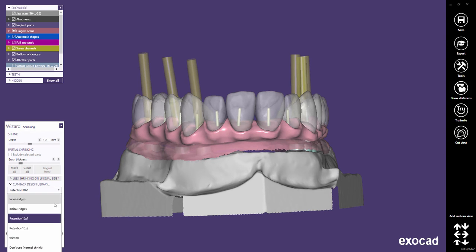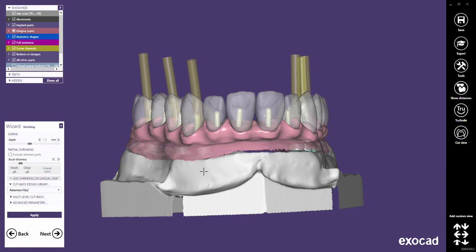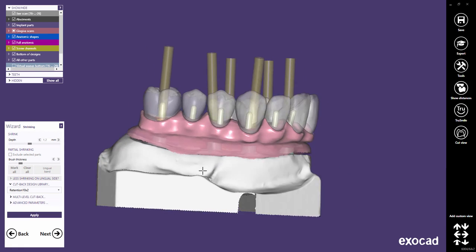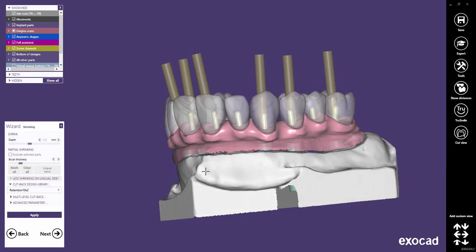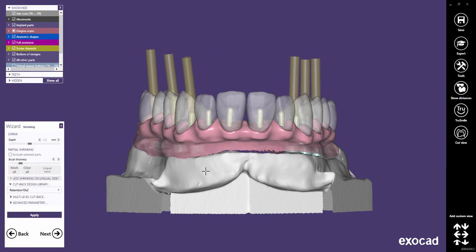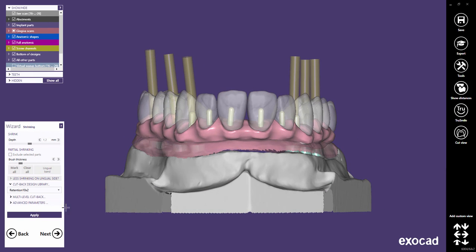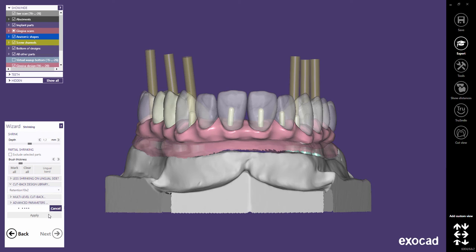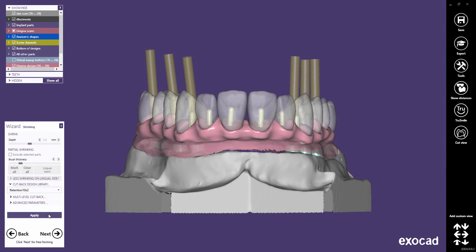Alternatively, select retentions with 2 mm diameter. Click Apply when you have selected the desired library, and proceed to the next step, which is free-forming the retentions.